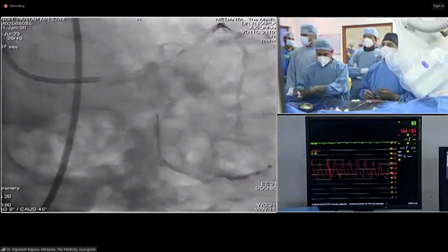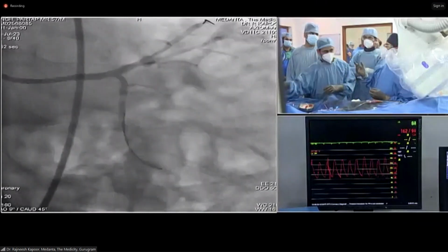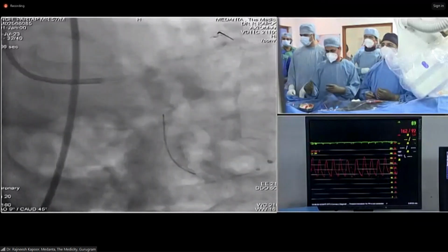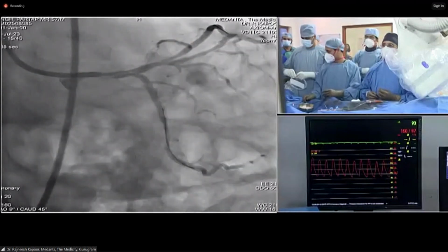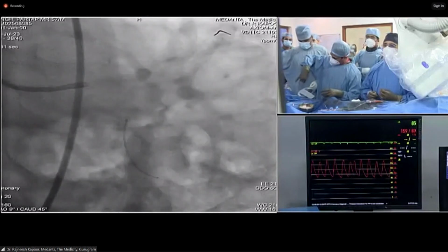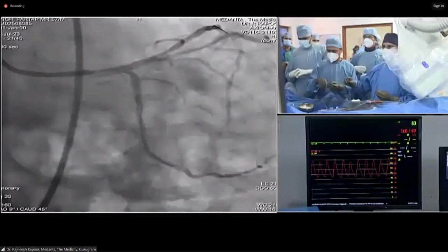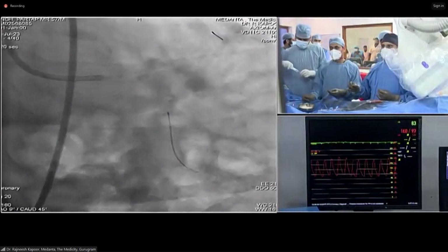Unlike other techniques, where in T-stenting and TAP stenting we would like to go more distal or the middle part of the struts. So this is an important thing that you have shown, that you have done the crossing from the proximal struts. And most important is that, as you said, after this kissing, usually we do a POT also in the proximal part, so that we don't again have a mismatch of the proximal part of the stent.